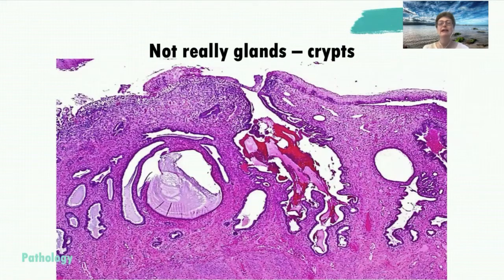We call them cervical glands, but in fact they're really crypts or pseudoglands. So this is the surface epithelium here, the squamous epithelium. And as part of squamous metaplasia, it is covered over the surface of a gland here. And we can see that this gland actually connects to the surface and is a crypt rather than a gland. So as squamous metaplasia happens, we can get the squamous metaplasia going into the glands here. Glandular extension of squamous metaplasia. This isn't invasion, this is a normal physiologic process.